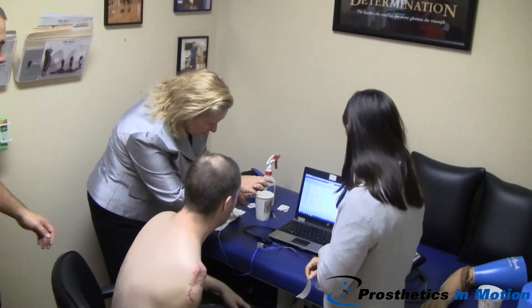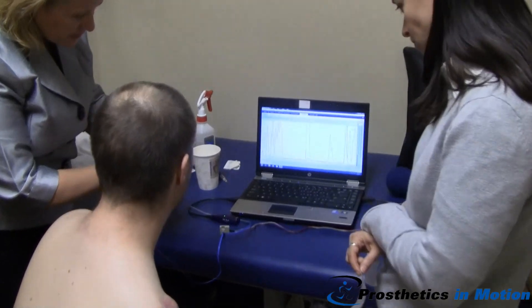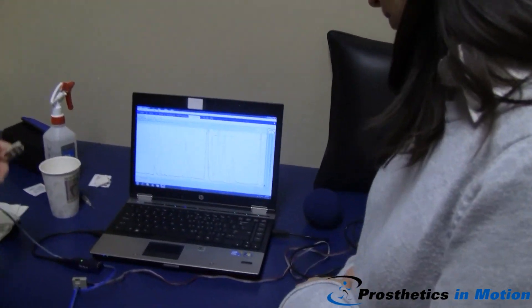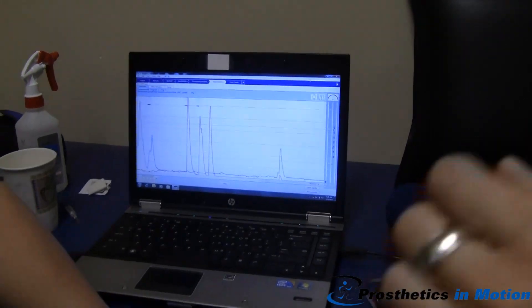The one you see here is the red on the screen, and that is typically used for opening. This one is the blue, and this is typically used for closing. So when we check the muscles in the back, we'll use this one, and then we'll use the other for the closing.